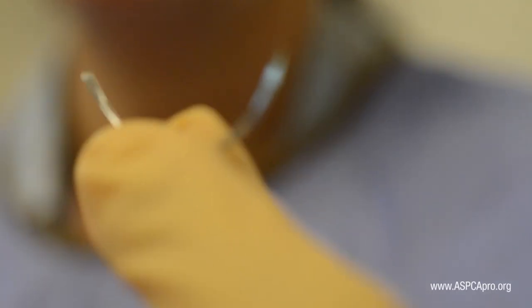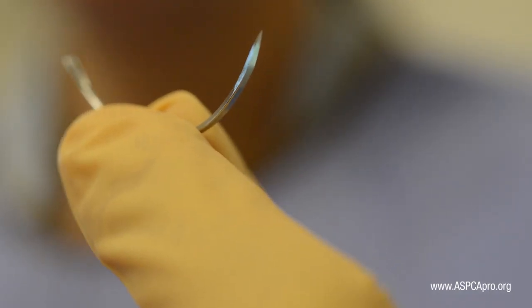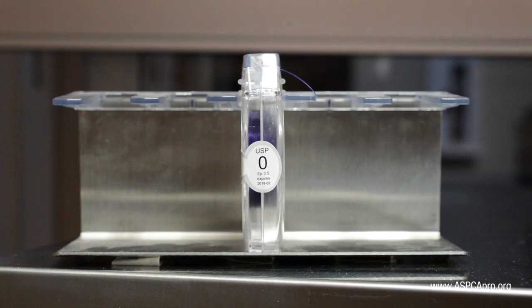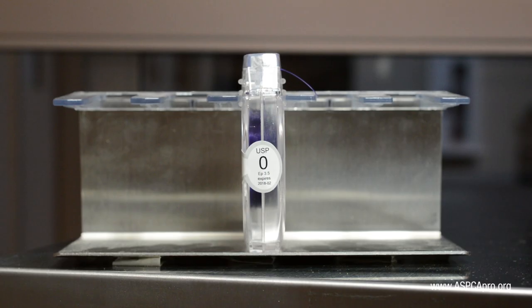With threading a needle rather than using swedged-on suture, there can be a definite learning curve. The first rule, however, is to always maintain sterility.